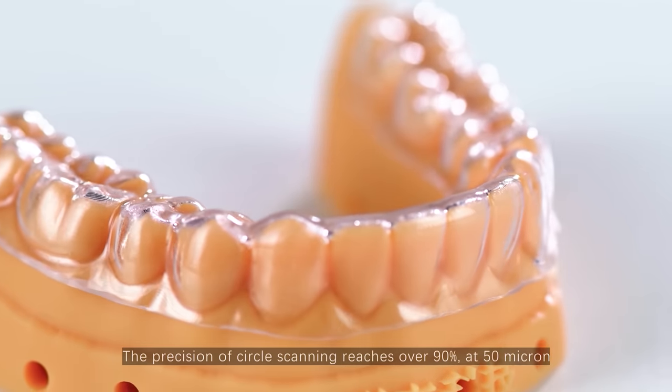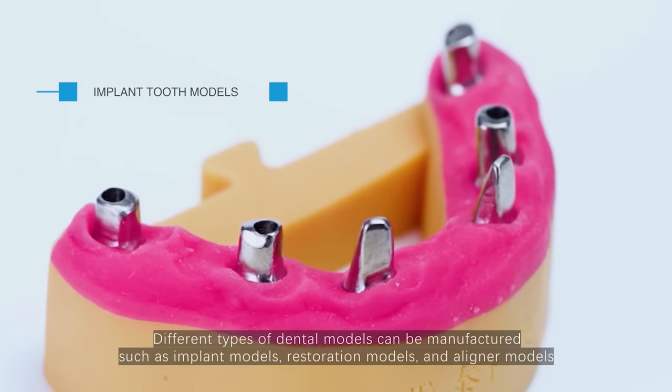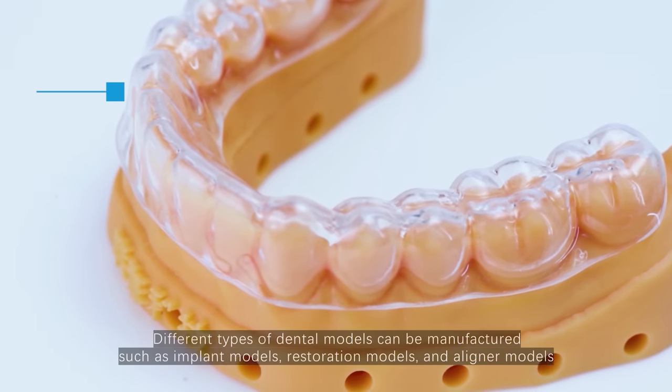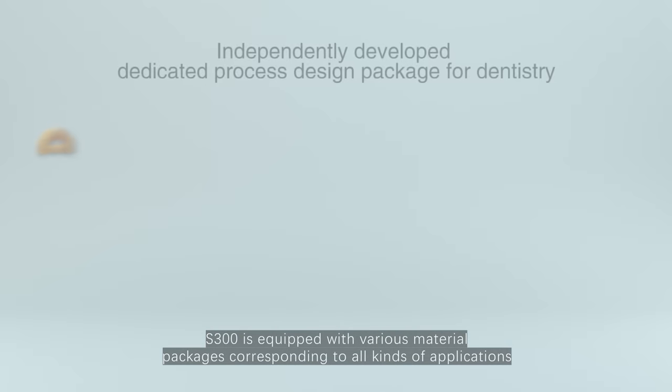The precision of circle scanning reaches over 90% at the 50 micron. Different types of dental models can be manufactured, such as implant models, restoration models and aligner models. S300 is equipped with various material packages corresponding to all kinds of applications.